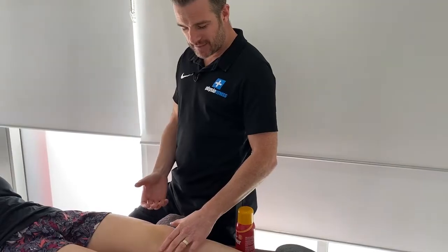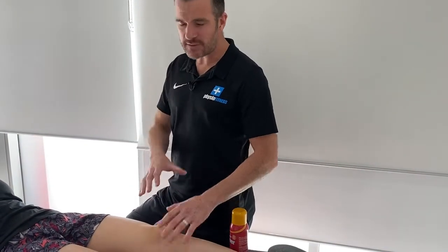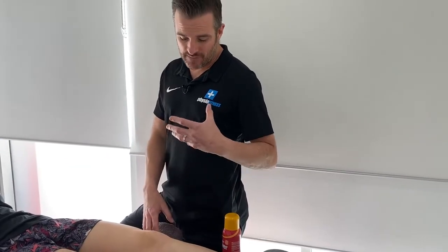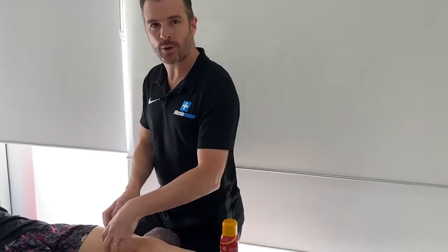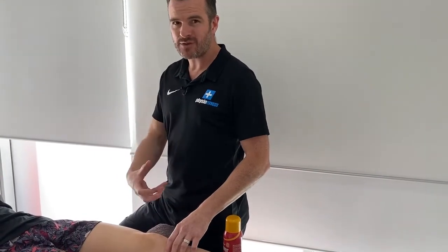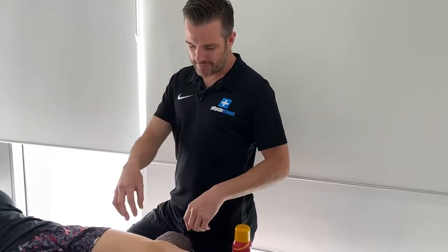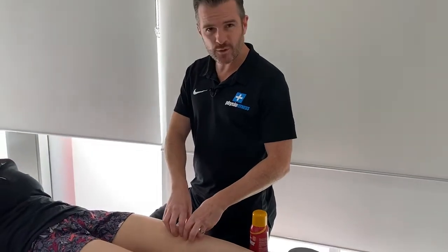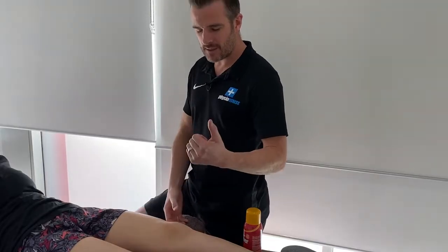So you're giving almost fake strength to this person, and it's a means to an end. It's not taping you should use all the time — it's a taping that allows the client to do the exercise to then build the quads, which then take over. You're doing it to enable them to, one, get out of pain, but mainly to be able to do their exercises. Some people, if they're really stuck with fluid, swelling, wear and tear, and a loss of quads, find it really hard to get their exercises done. This tape helps with that.